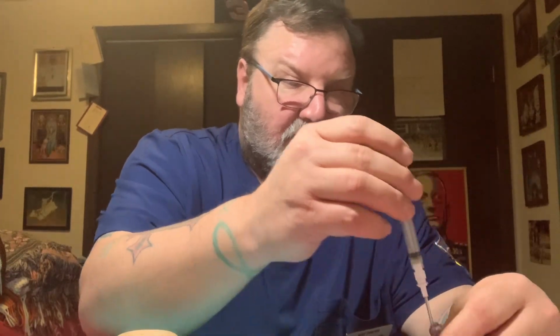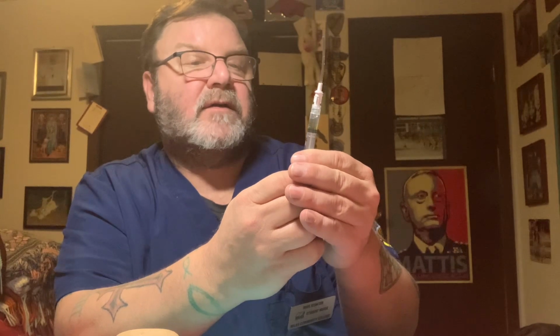And I am going to invert and withdraw 1 milliliter. And then I will return the medication. And I'm going to draw 0.2 milliliters of air.